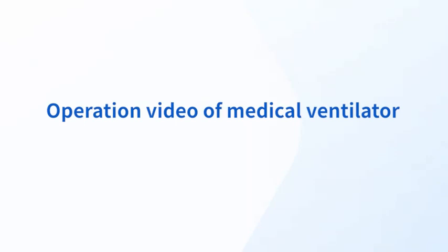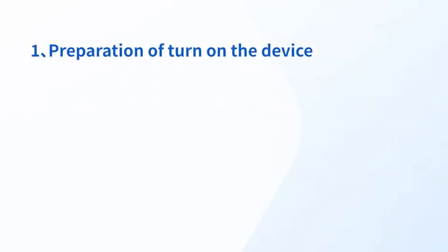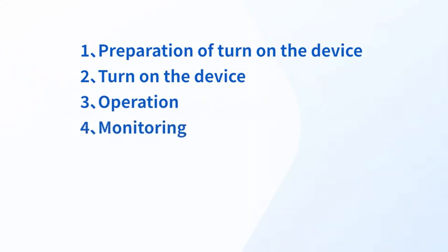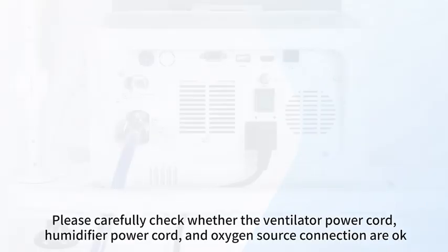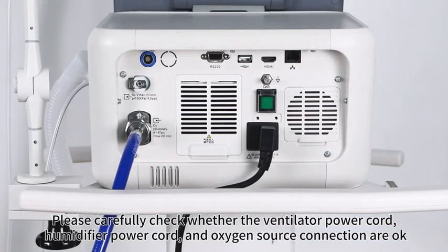Operation video of medical ventilator. Preparation to turn on the device. Please carefully check whether the ventilator power cord, humidifier power cord, and oxygen source connection are okay.